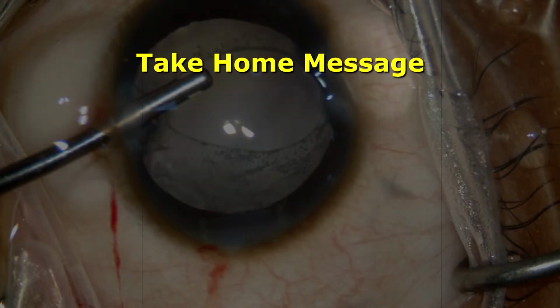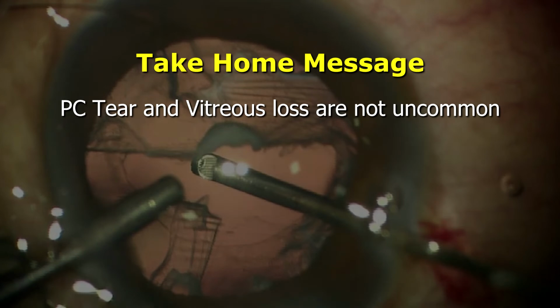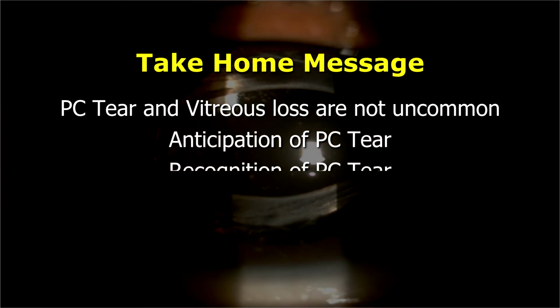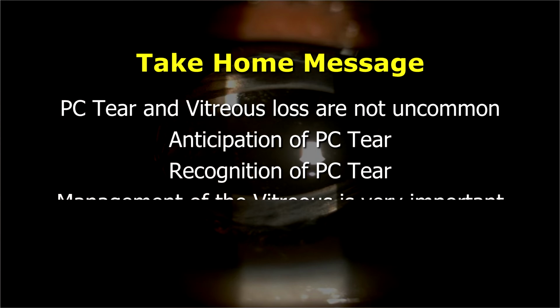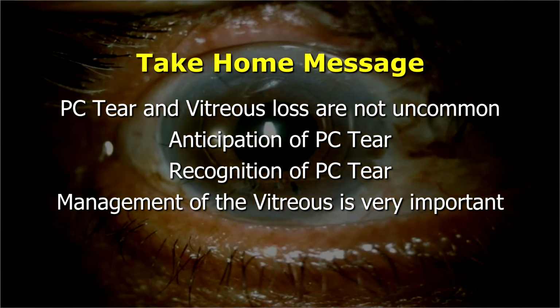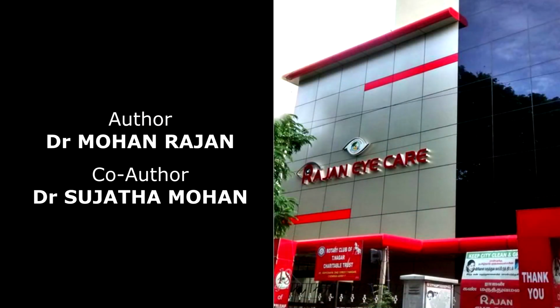The take-home message is PC tear and vitreous loss are not uncommon. They can occur even to the experienced surgeons. Anticipation of the PC tear, recognition of the PC tear, and management of the vitreous is very important for the good outcome and long-term outcome for these patients.